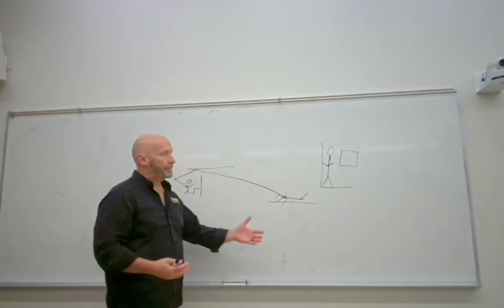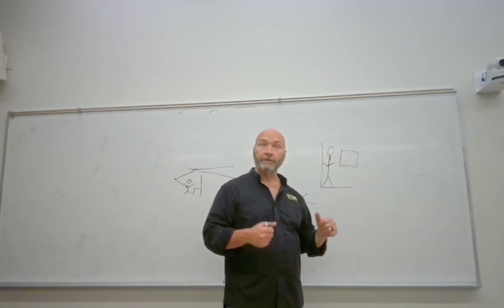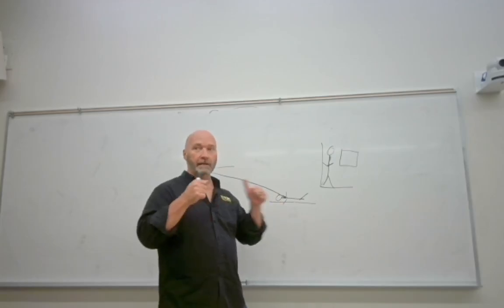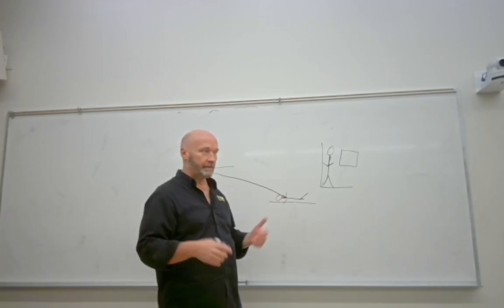As you're setting your room up, getting ready for an upper GI or barium swallow or something like that, where you're going to start with the patient standing up, the first thing you have to do is put that foot piece on. The second thing you have to do is make sure that foot piece is on there solid, right? So you shake it and try to knock it loose. And if it doesn't come loose, then it's good.